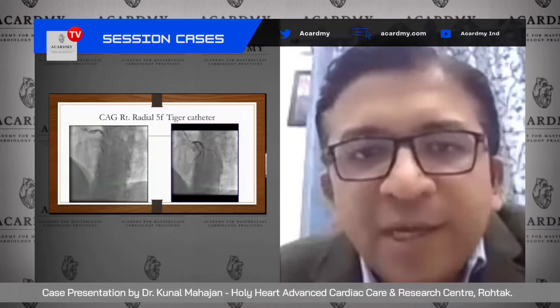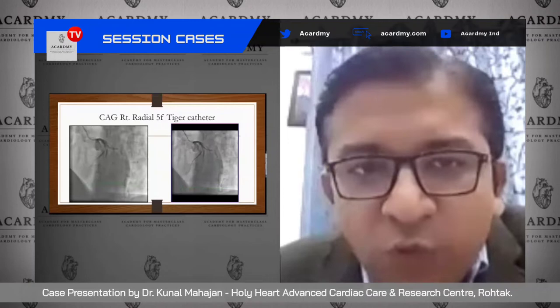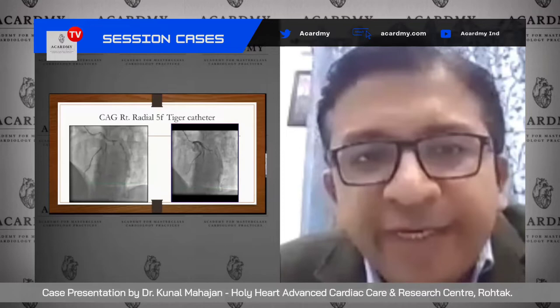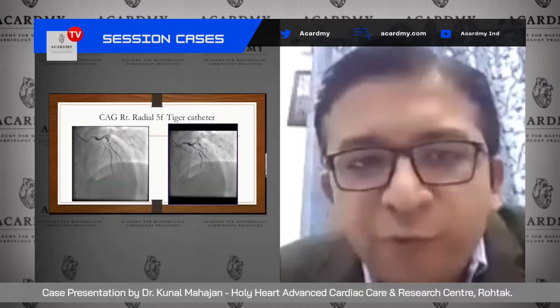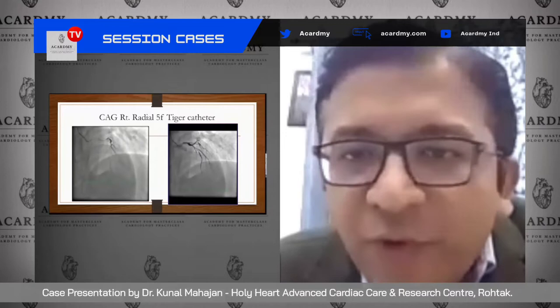There was bifurcation disease of LAD-diagonal, very clearly visible in the LAO cranial view. It was Medina 1-1-1, and the diagonal ostium was very tight, although focal. The LAD disease was also very critical. There was also disease of the left circumflex, better appreciated in the caudal view. In the AP view, the Medina 1-1-1 bifurcation disease of LAD-diagonal and a very critical stenosis of the LAD — almost 95% — was also apparent.